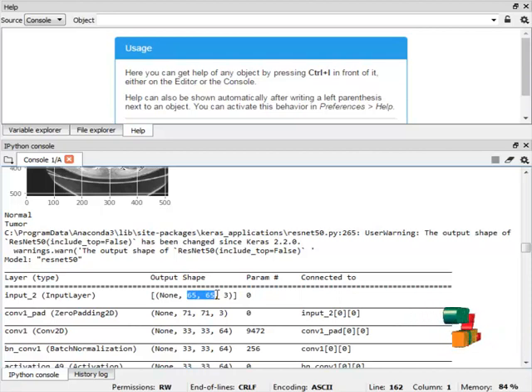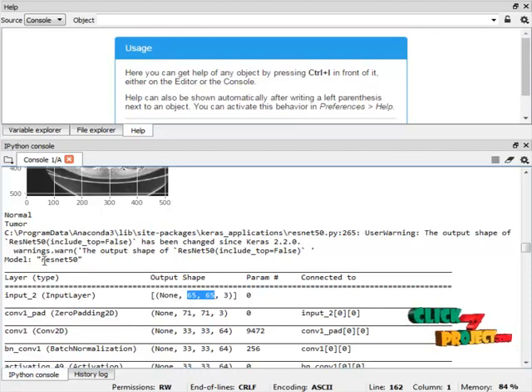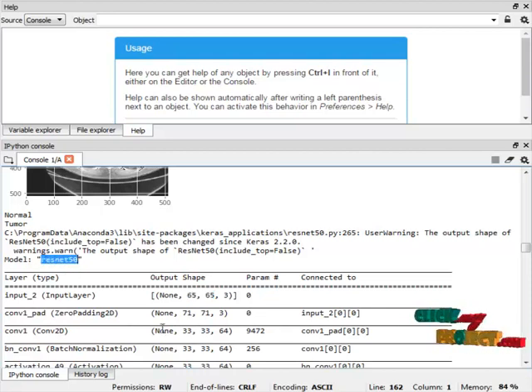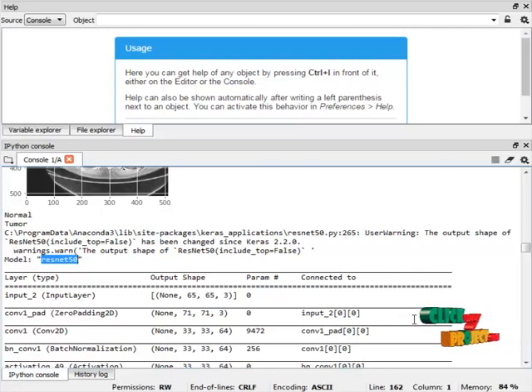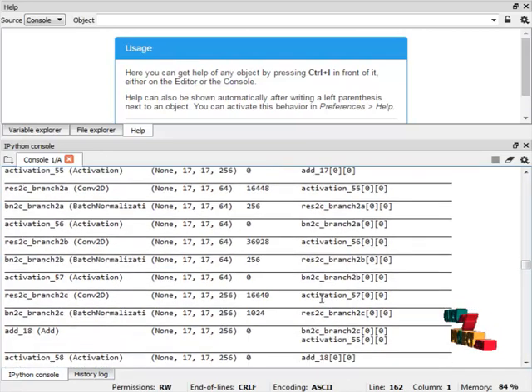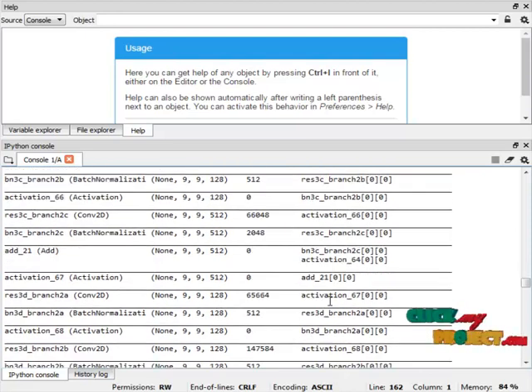After pre-processing, the feature extraction method is applied using the ResNet-50 algorithm. It is a transfer learning algorithm used to extract features from both normal and tumour liver CT images. The summary results of the ResNet-50 algorithm are also displayed.